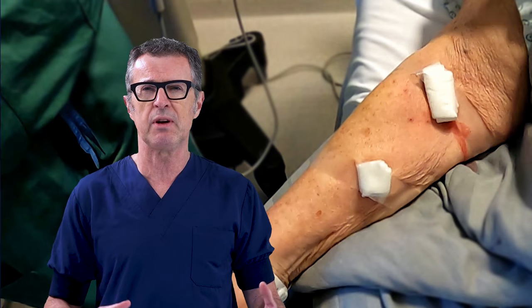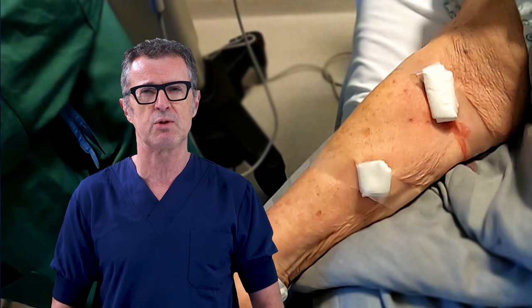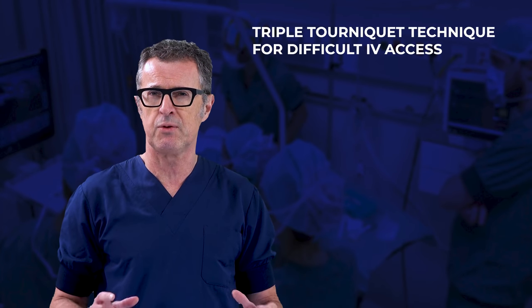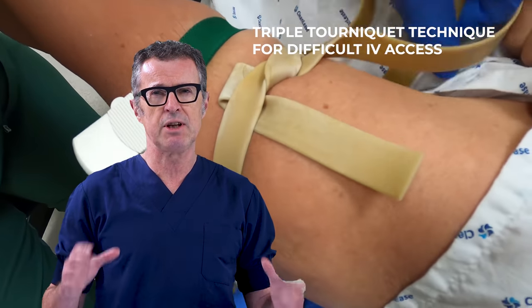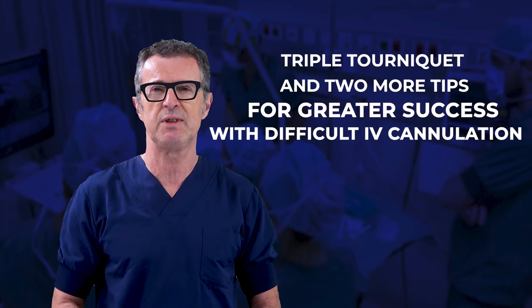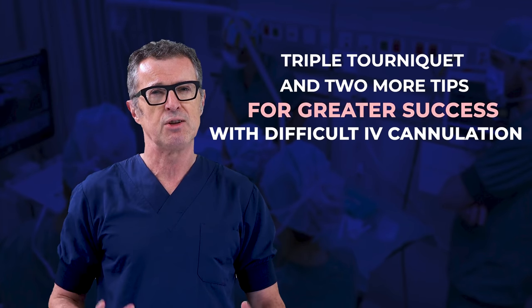However, there may be times when difficult IV access can also be solved by a simpler and faster method. In this video, we are going to describe the technique of triple tourniquet, and I will teach two additional important principles for successful peripheral venous cannulation in patients with difficult IV access. So let's get started.